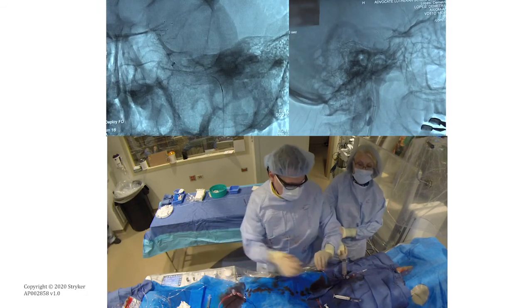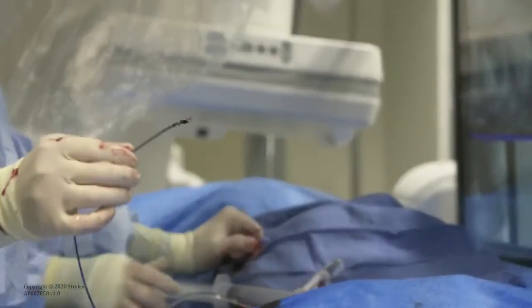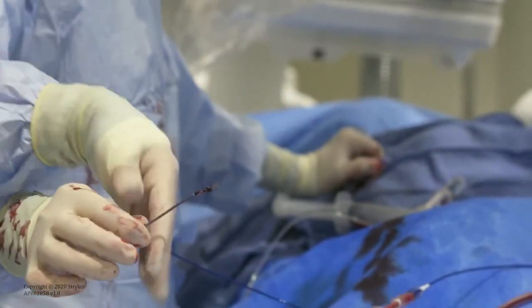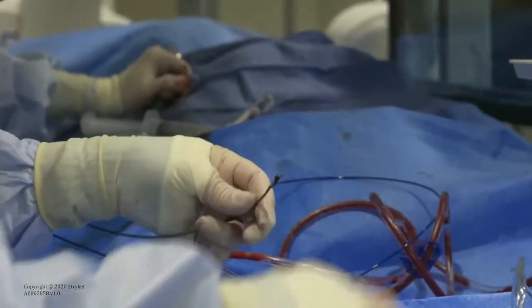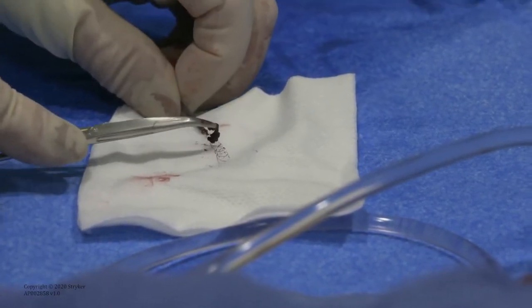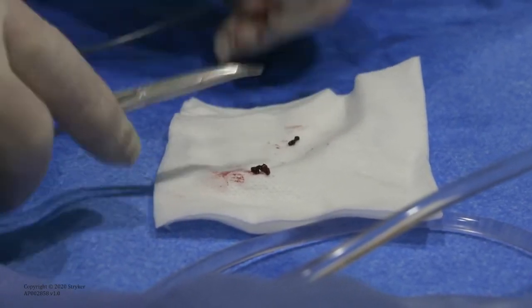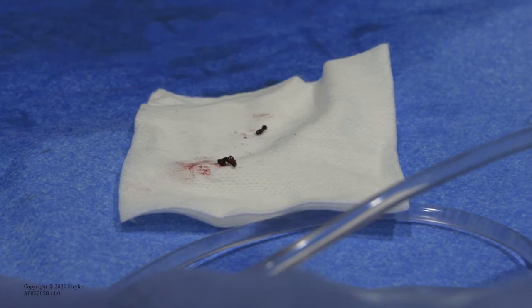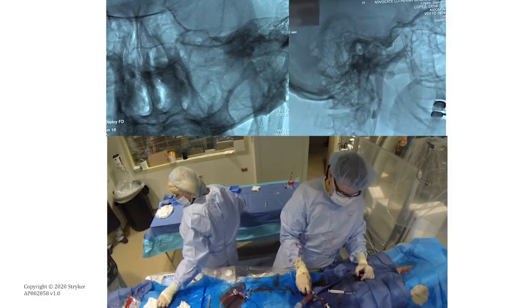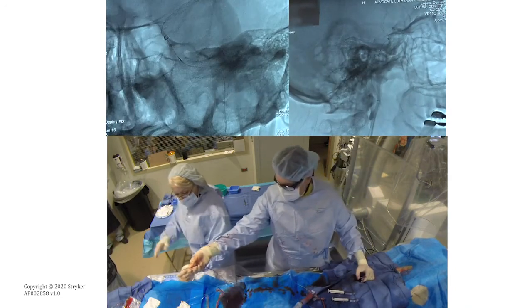The balloon guide is still up, and you can see that I tend to disconnect and allow for back bleeding. You can see that the clot is in the middle of the stent retriever, which is why the length is always important, having a 30, because the clot didn't roll out of the stent retriever. And you can see how well integrated it is, hard to remove, and very much trapped in there. Many times, depending on the type of clot, you also have more of a component in the Cat 7, but in this case it was very much connected to the stent retriever.